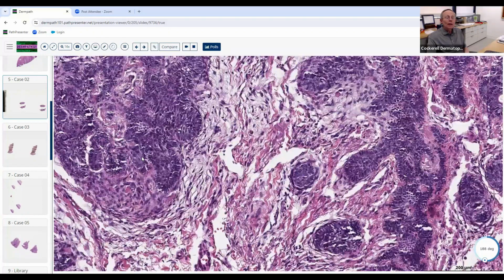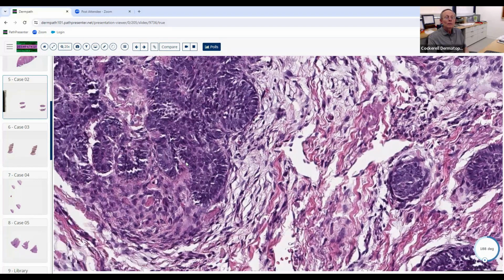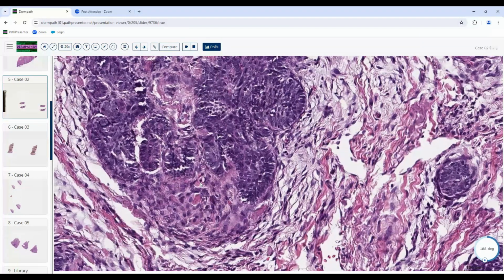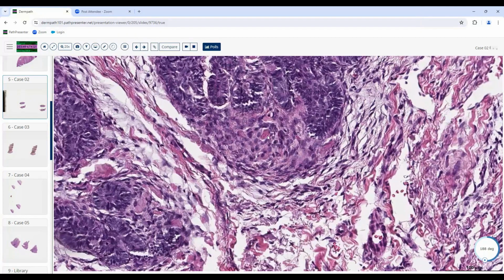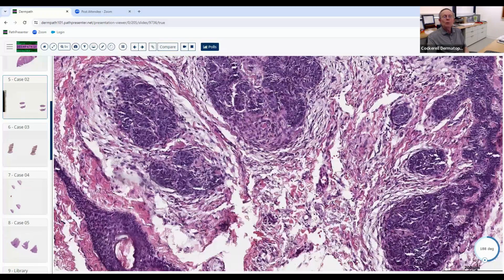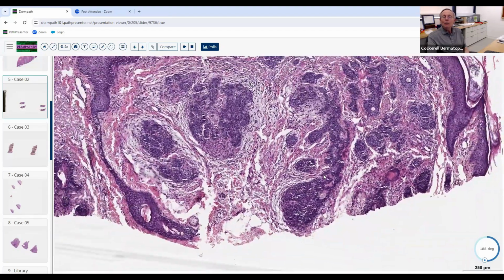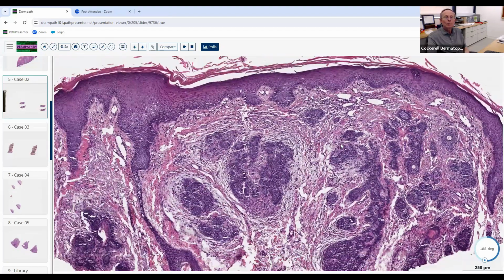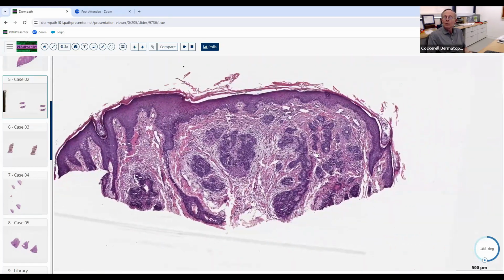Yeah, and there's one other thing that you can see, like maybe right here, that's helpful. I was having trouble finding a papillary mesenchymal body. Yeah, they're not as great in this one as in some. That's probably one here, a little abortive one. That's probably one there. So those are the things you do look for. You're exactly right. Some other things that you sometimes see, some calcification and little small cysts with calcium in them. Those are often seen more in desmoplastic trichoepithelioma than in the garden variety trichoepithelioma.